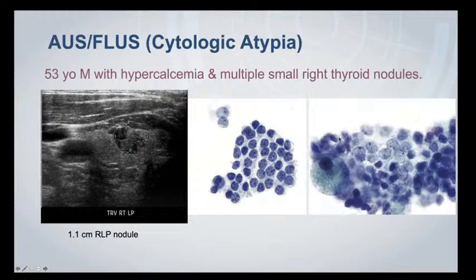And there was one other group of cells that had enlarged nuclei with some somewhat irregular nuclear borders and clearly finely textured chromatin. But again, remember that these two groups were the only two groups that looked like this, a tiny proportion of the entire specimen. Now, you wish you hadn't seen them because you would have just called this a benign follicular nodule.